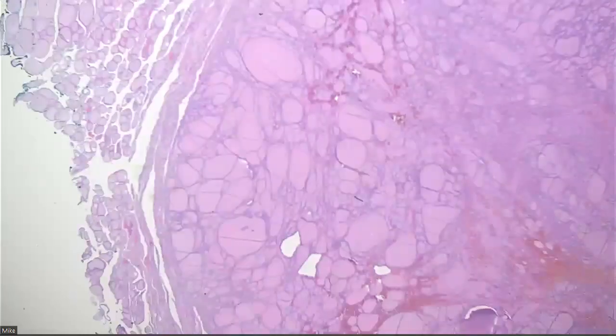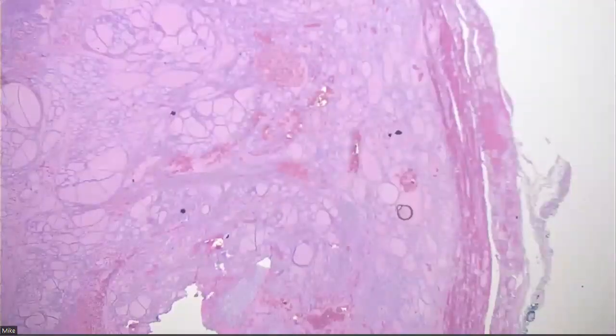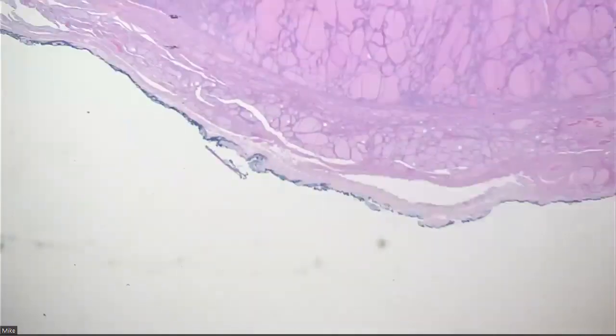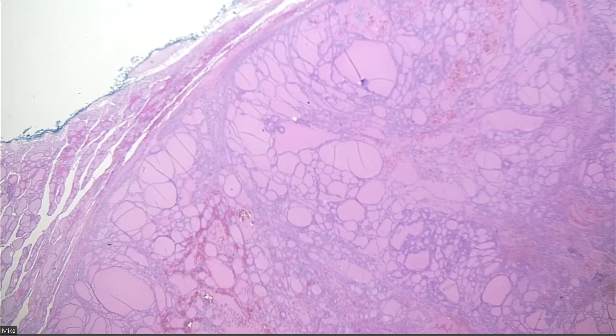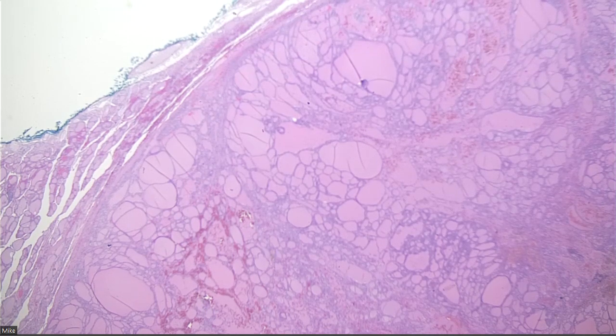I would throw it in the adenomatous nodule with nuclear atypia / NIFT-P bucket, right? And those of you who've signed out with me know that I don't top-line my diagnoses as NIFT-P, because I think it's a lot of words. I call them adenomatous nodules with nuclear atypia, or cytologic atypia, or architectural atypia, or whatever, with atypia. See comment: by the way, this would fit the criteria for what we now know as NIFT-P, but basically these are adenomatous nodules with nuclear atypia. So follicular neoplasm with nuclear atypia for me is basically NIFT-P.